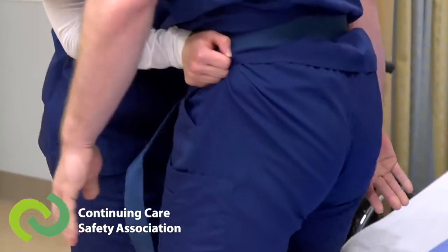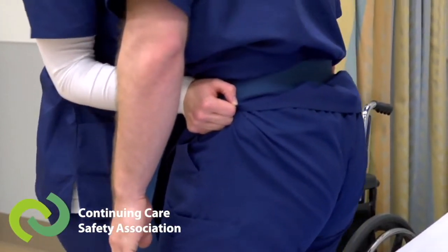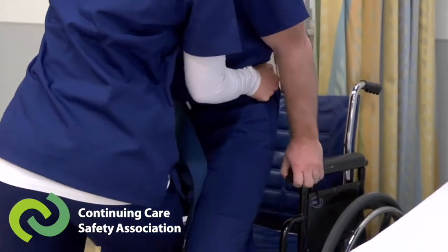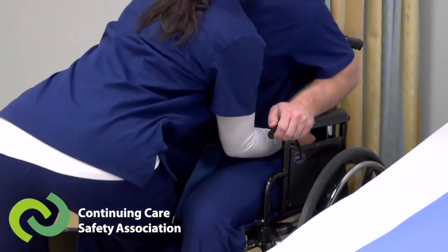Please note, in order for this transfer to be done safely, a transfer belt should be used every time. By making small adjustments to how we do these transfers, we make them safer both for the caregivers and the residents.